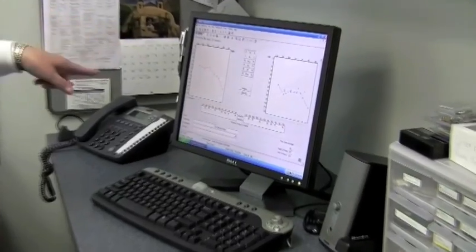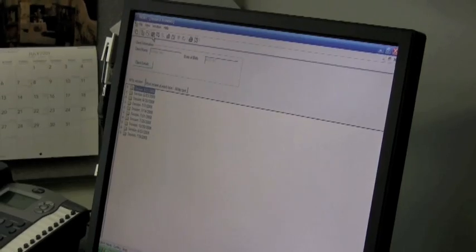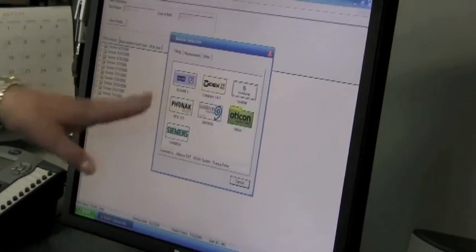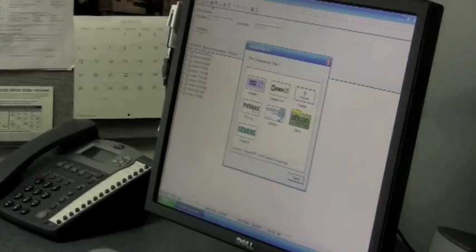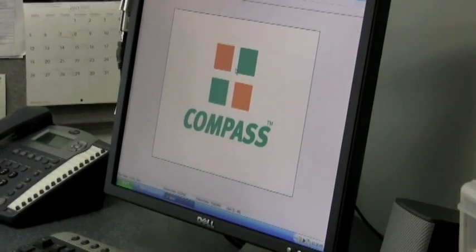You're going to hook it up to the computer software, launch the program, put the patient's audiogram in. That's Jean's. And then it launches the manufacturer window, and these are the hearing aid manufacturers that we have used. Then you just launch the one she's using, and you go right into their fitting software.